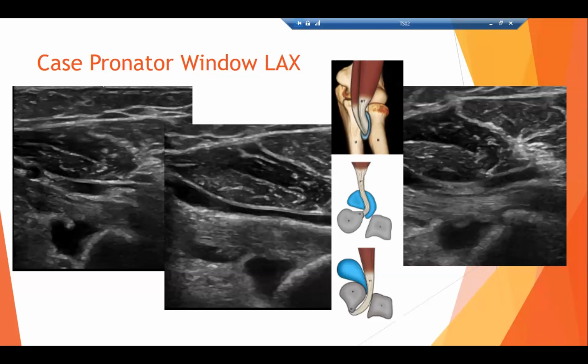As you're looking and trying to figure out, gosh, is this just bicipitoradial bursa fluid? Is there any joint fluid? I'd just say for anyone who's getting into scanning, remember that looking in the posterior elbow joint is a good place to look for elbow joint recess, probably a little bit better than the anterior elbow joint. So don't be afraid to move around the backside, even though you're doing an anterior scan, to get those other couple of views.